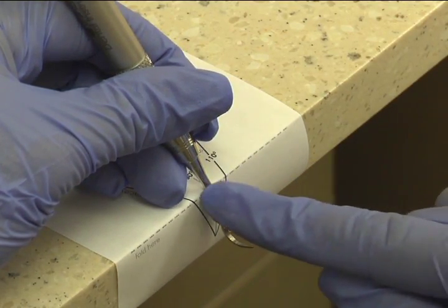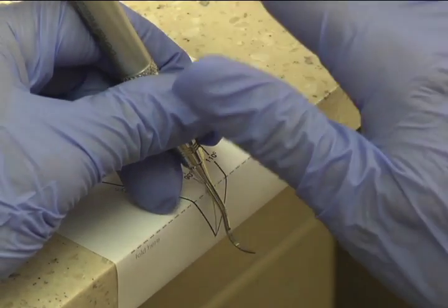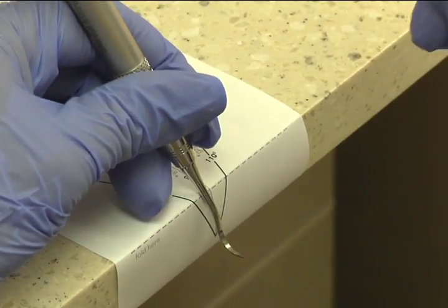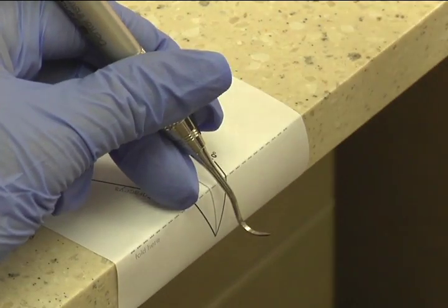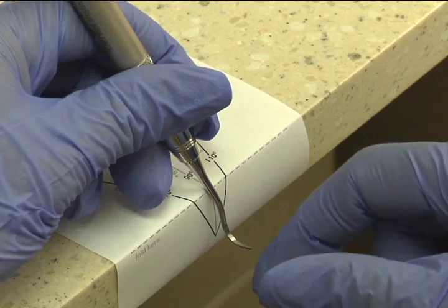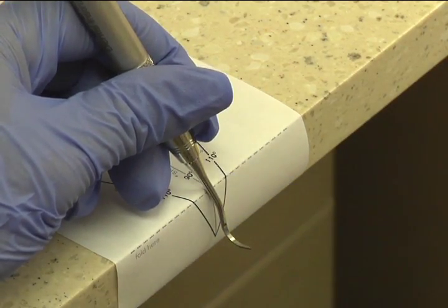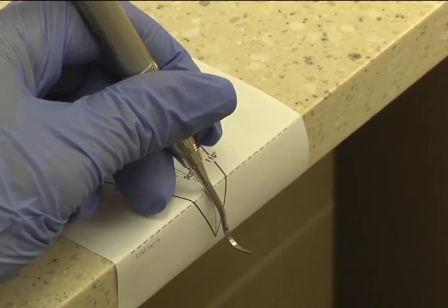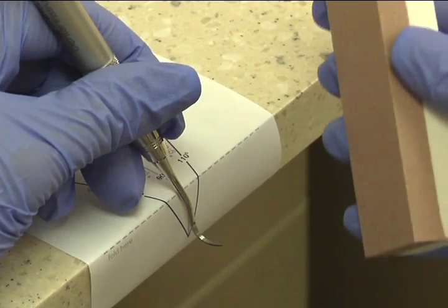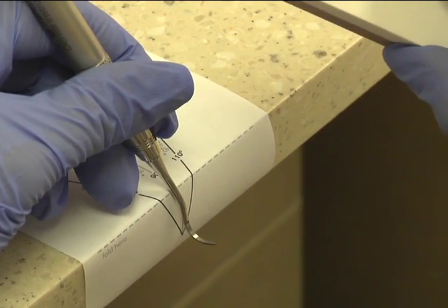I'm also resting my instrument on the countertop. And I don't have, I call it the death grip, because I see so many people and they have everything so tight that it makes the whole sharpening process a very exhausting thing to do. So just hold it nicely, but you want to apply pressure here so you're stabilizing the instrument. Again, my arm is resting. I'm going to use the Edge 2, which is the coarse side on one side and the fine medium on the other side.